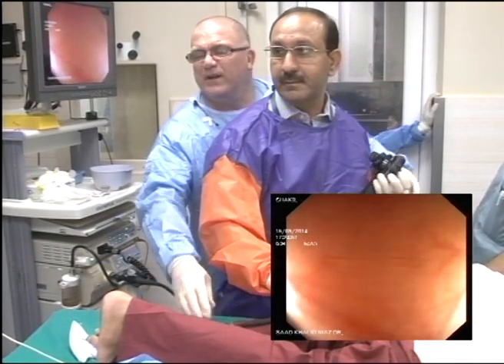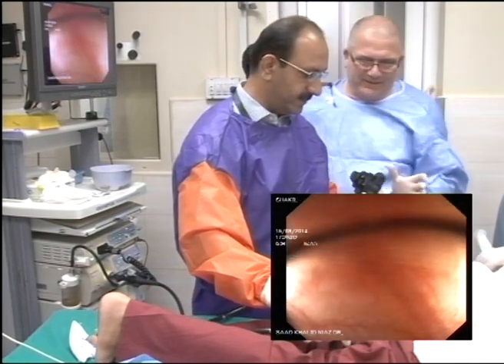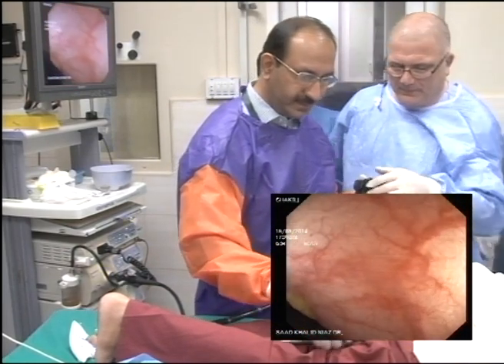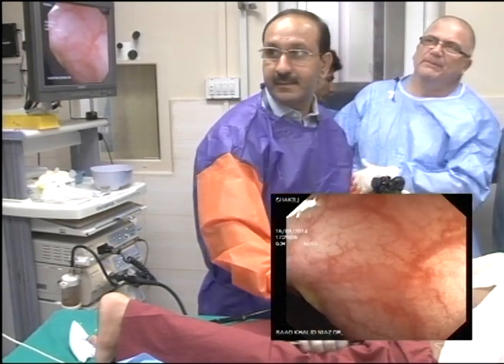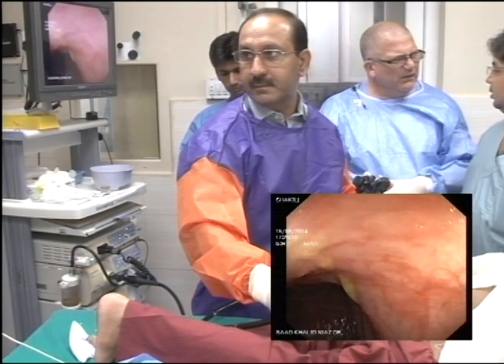Now, for some reason I gave you a straight scope and now you've got all sorts of tension in the scope. Okay? That's better now. I think it'll help you.